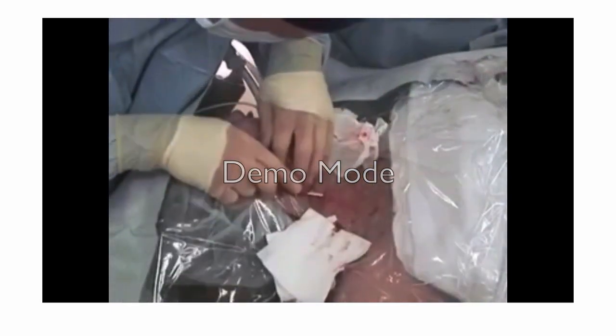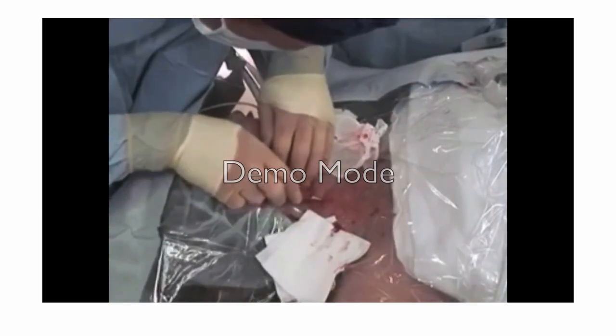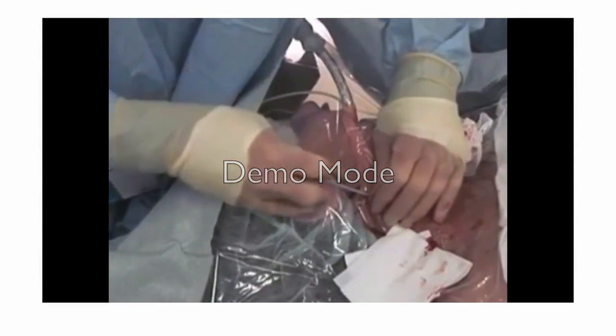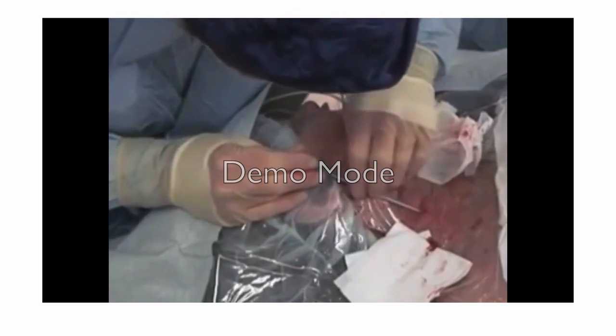and with the scalpel make a skin cut to allow the dilator to go through that hole. Now use the dilator through the guide wire down to the skin hole. Apply a little bit of force with the dilator.